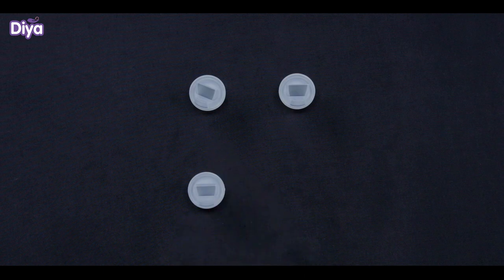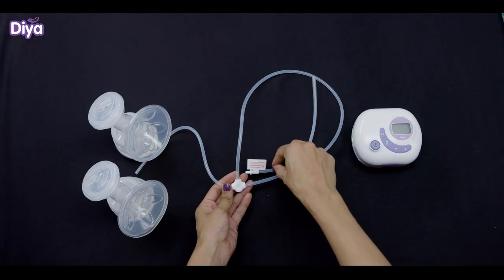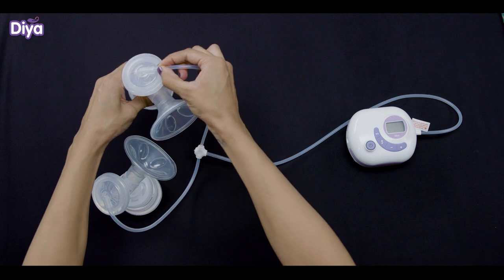There are two extra duckbill valves which can be used in case any of the duckbill valves is lost or spoiled. Attach a storage container with each connector. Now connect the longer side of the double pumping tube to the pump and insert the two-way small tube into the hole of the cylinder cover.